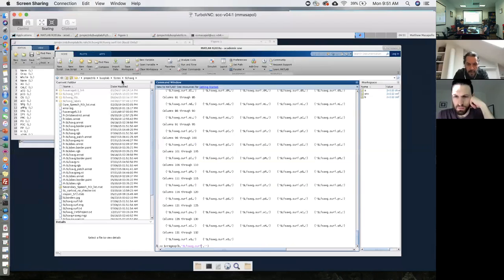If it's easier for this tutorial example, we could just do like pre-SMA and SMA. Right. Well, I mean, it's going to be the same. We need to find the corresponding numbers associated with it. The whole idea is basically this. We need to figure out which ones are the numbers associated with those two ROIs. And then we need to create a different file that combines those two or three or whatever number of ROIs that we have, and only those voxels have a value of 1 and everything else has a value of 0.